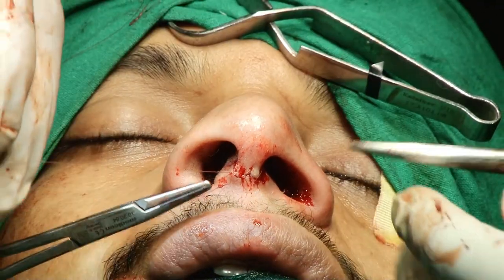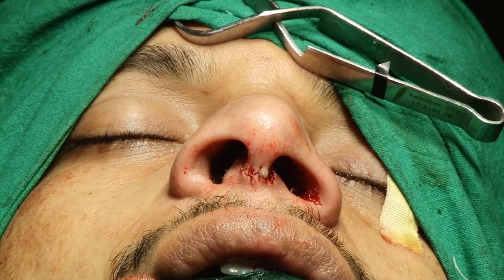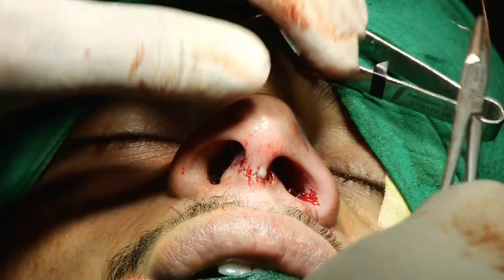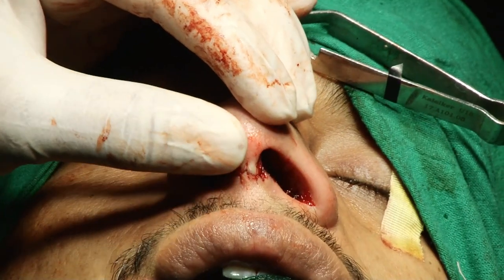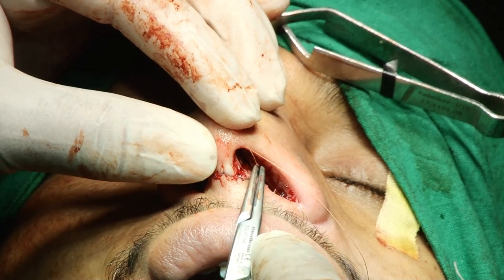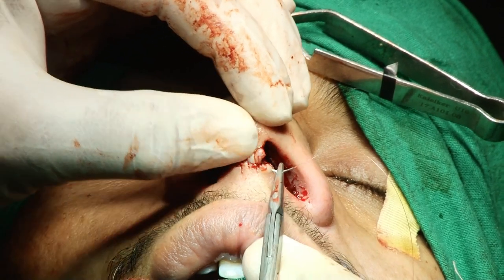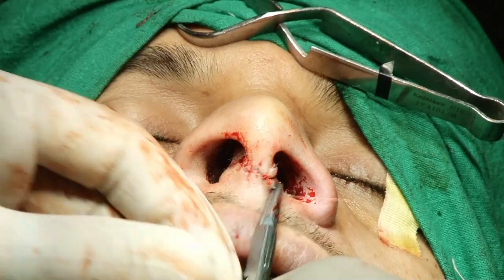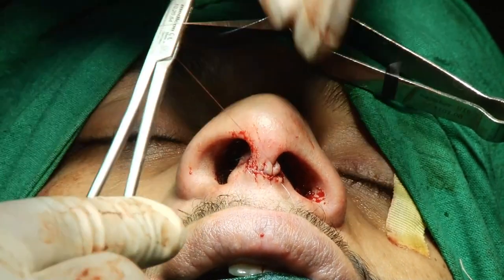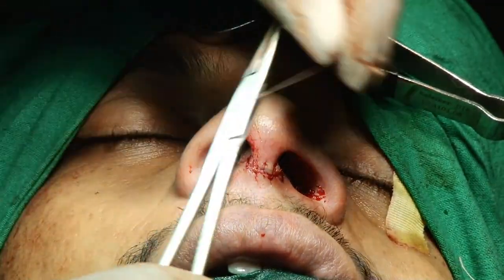What do you use for closing your patient's transcolumellar incision? What material? I think when we first met, you were using nylon, and I said to you, try the Vicryl Rapid, and I think you changed now. Yeah, well, it works very well. Or you can even use a 7-0, but the problem with the 7-0 is that it's a tiny little needle. 6-0 is also good, sir.